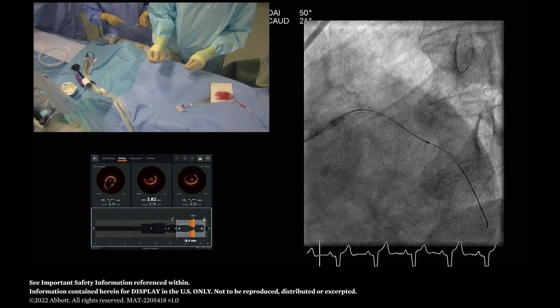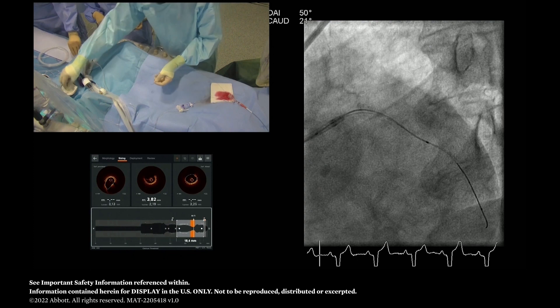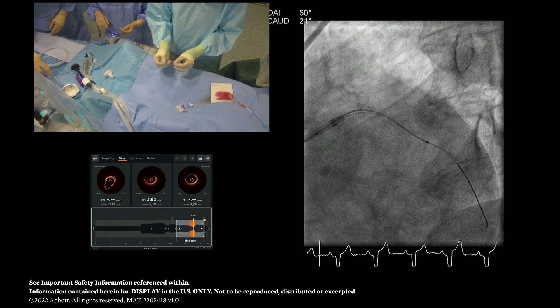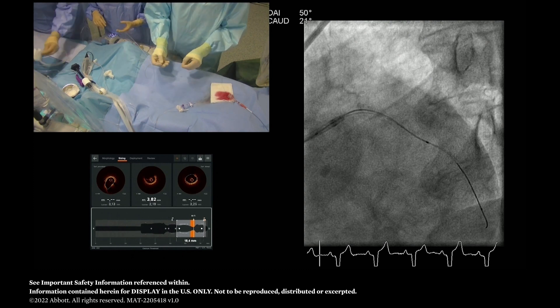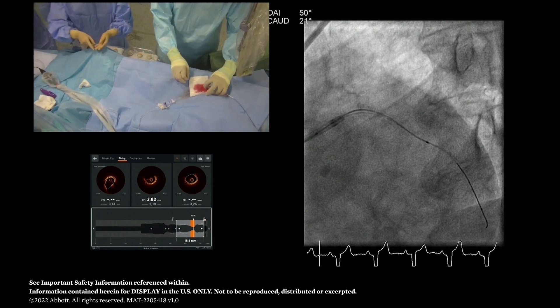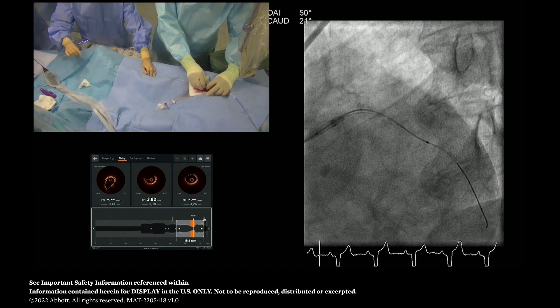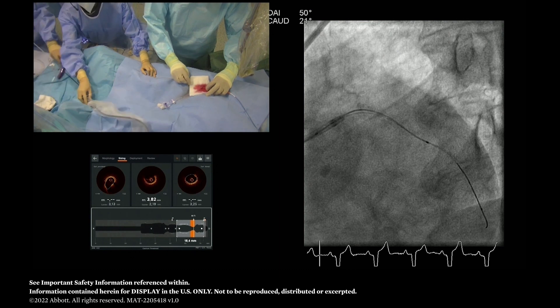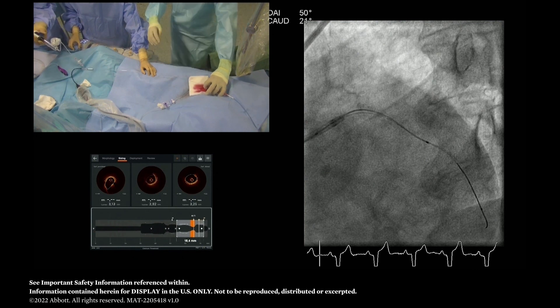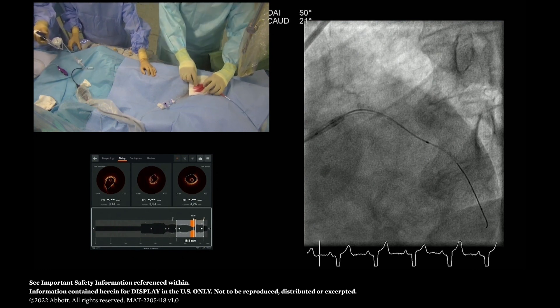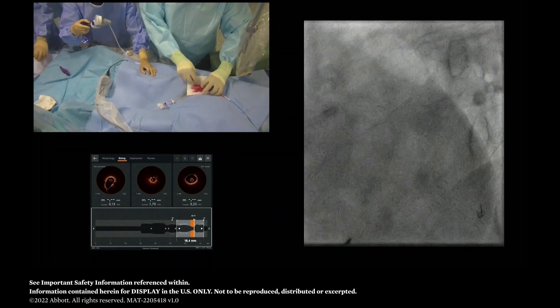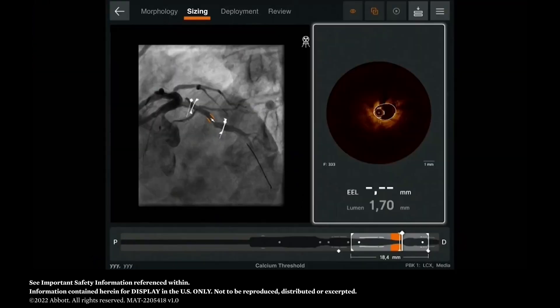It looks like a very good type of lesion for using lithotripsy. We have seen that we have been able to advance the previous gear, so let's see how the IVL balloon goes here. Let's try first to advance the system without a guiding catheter extension. We have to remember — this is something interesting from what we saw — if we want to advance the guiding catheter extension, we have a calcific nodule in the ostium of the circumflex, which may be a small obstacle. Knowing this type of information will improve the safety of the procedure.